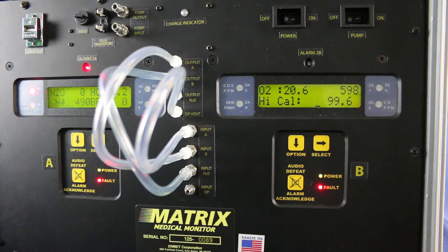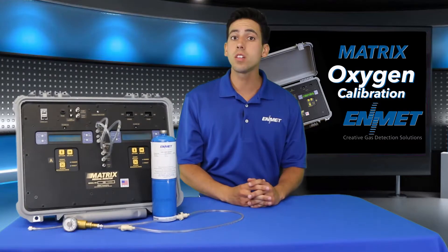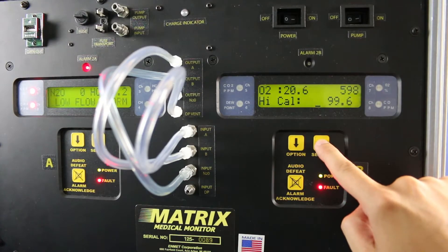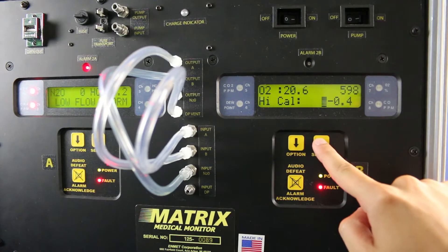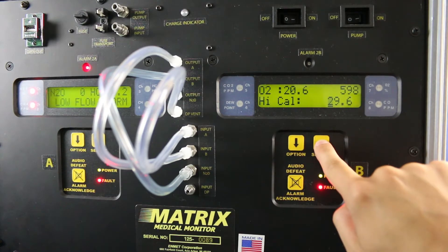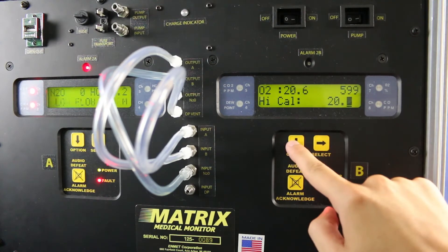To change the value from 99.6 to 20.9, you must first place the cursor left of the 99.6. To do this, press the select button until the value turns negative. Once the value is negative, move the cursor over by pressing select, then use the select and option keys to change the value to 20.9.